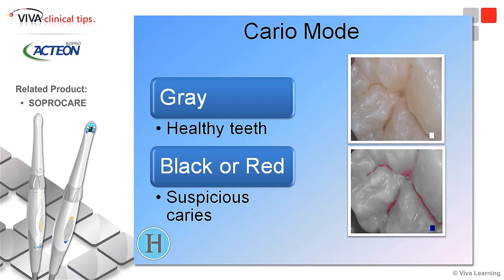If you're concerned whether this is a false positive, you just have to go in and do a professional cleaning, and if it still shows up, you know that it is definitely needing to be treated. So don't you agree that this technology, along with the way that we typically have collected data, could be the difference between the patient really being able to identify their disease level and own it?